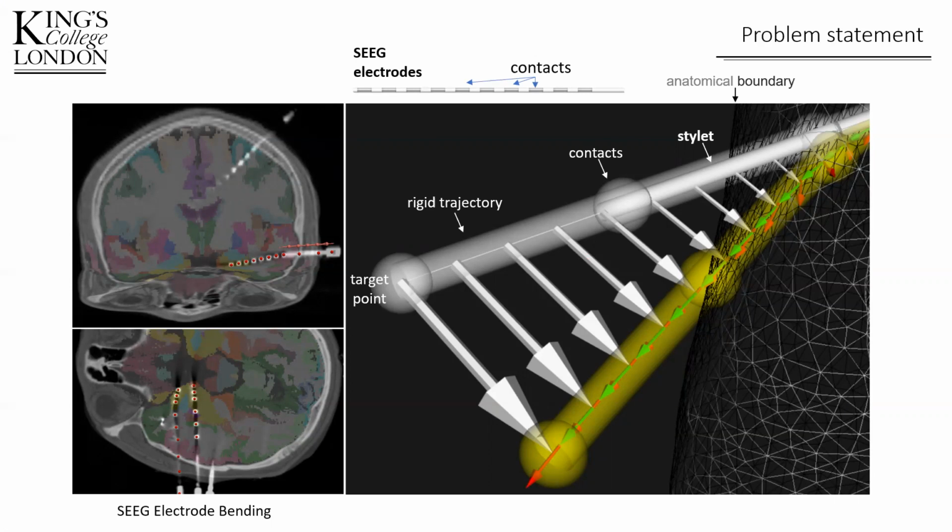However, when identifying electrode trajectories from post-operative CT scans, implanted trajectories deviate from planning. And we can observe that the electrode bending direction changes as the electrode bends, due to small local displacements along the trajectory that become particularly large when electrode bending occurs. Therefore, being able to account for electrode bending during surgical planning could further optimize accuracy and safety.